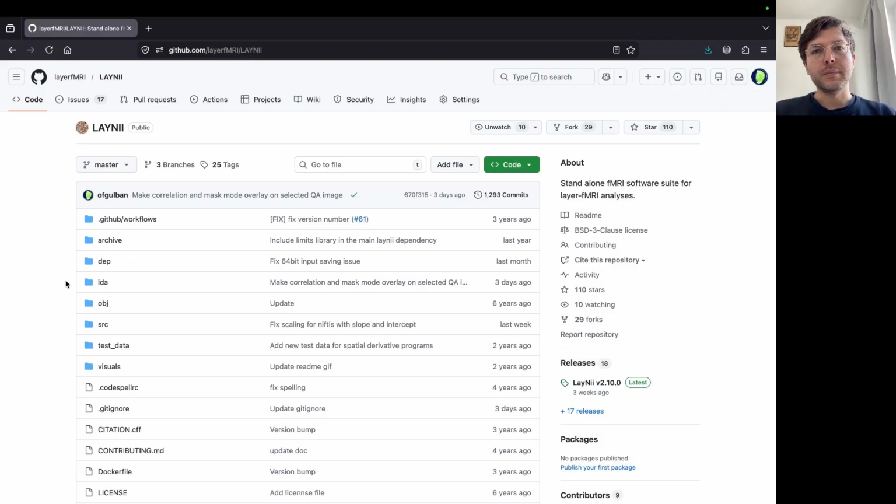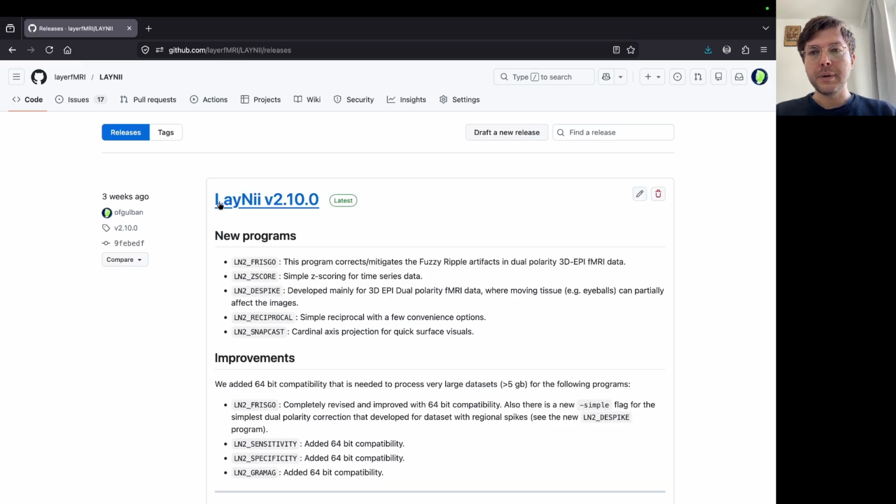Hello and welcome. Today in this video I am going to show you the new features in LayNii IDA that we have released together with LayNii version 2.10. So if you go to our GitHub page, LayNii, and navigate to releases, you will see that we have recently published the LayNii version 2.10.